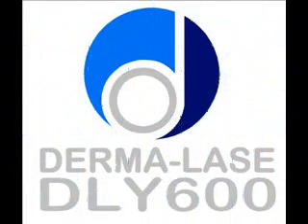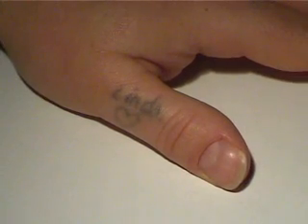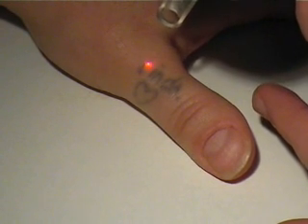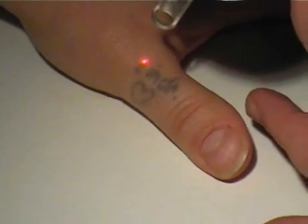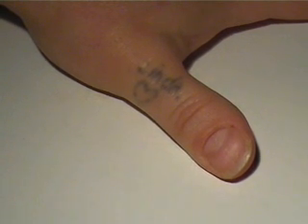The Dermalase DLY 600 Q-switch laser. This laser was designed to treat both professional and amateur tattoos. In this case, a small homemade amateur tattoo is presented on the thumb. This tattoo is about 35 years old and was made with Indian ink. This is the first treatment.